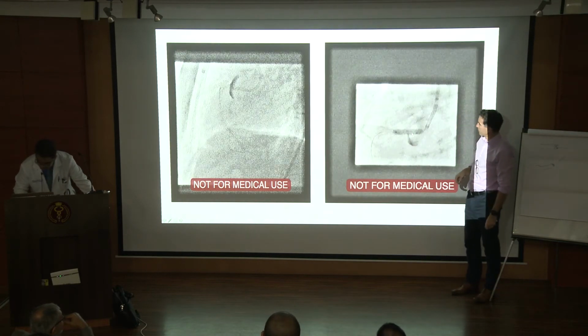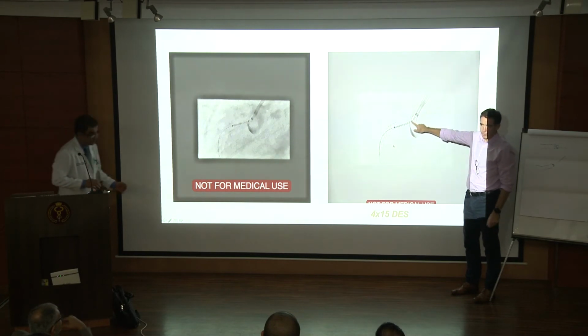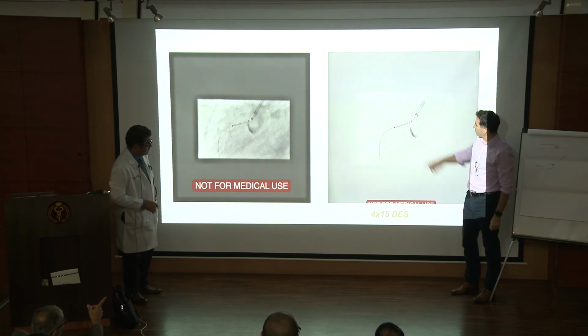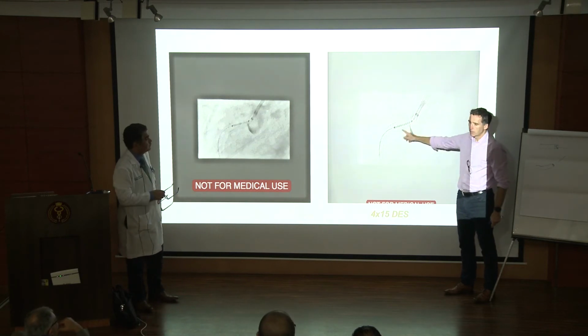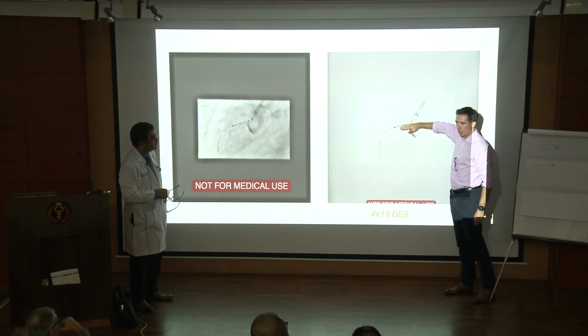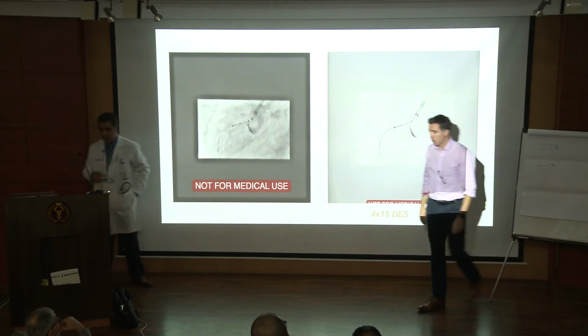Hang on. See here, you've got some contrast in the cusp that makes it clear. Yes. But assuming you don't see the contrast, look at the alignment of the stent. See the stent? You know that's right at it. If that was not lifting up, you've missed it. But it's very subtle.